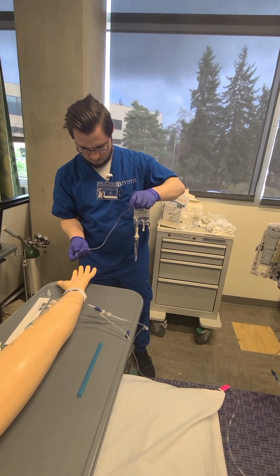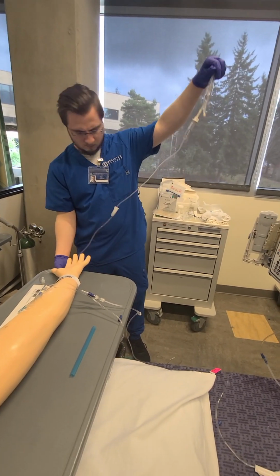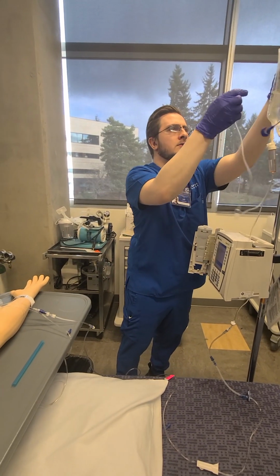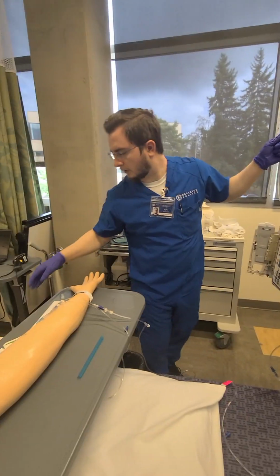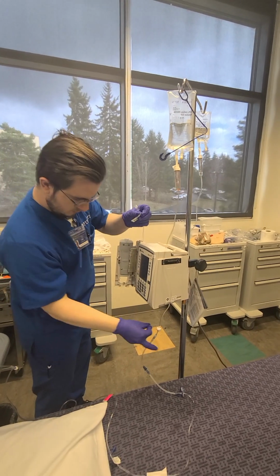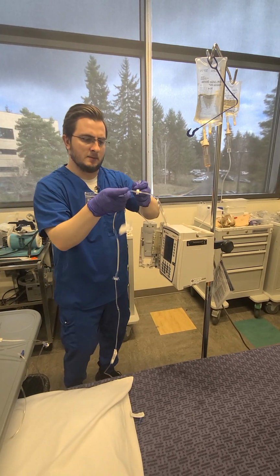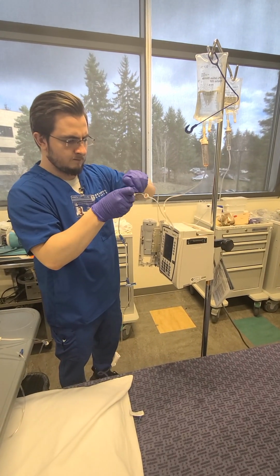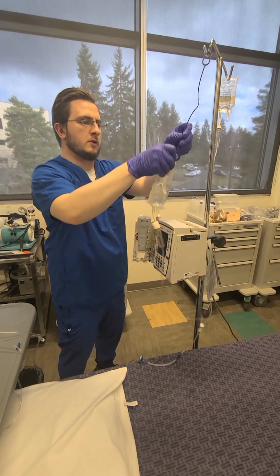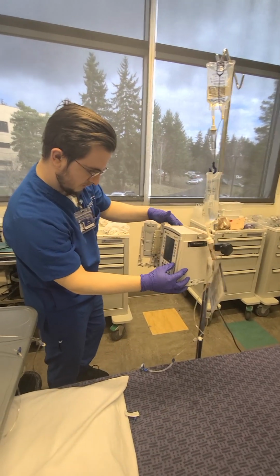Connected to our primary tubing. It's here for right now. We gotta get another one of these. About 15 to 30 seconds. Wait for 30 seconds. Sorry about that, Erica. Okay, both my lines are primed. Hang my primary lower than my secondary. All right. Now let's get this.